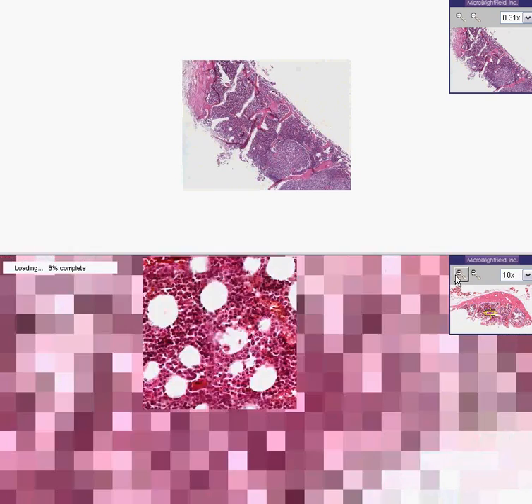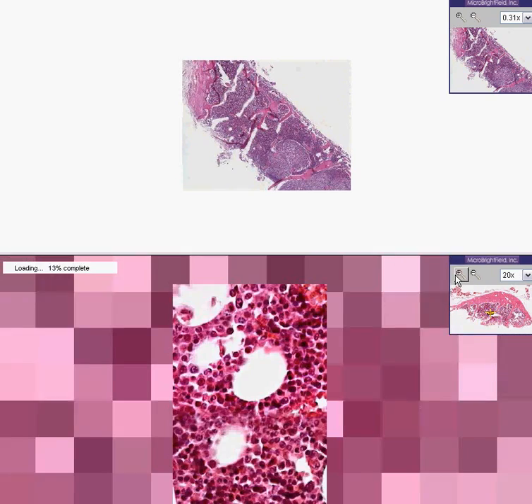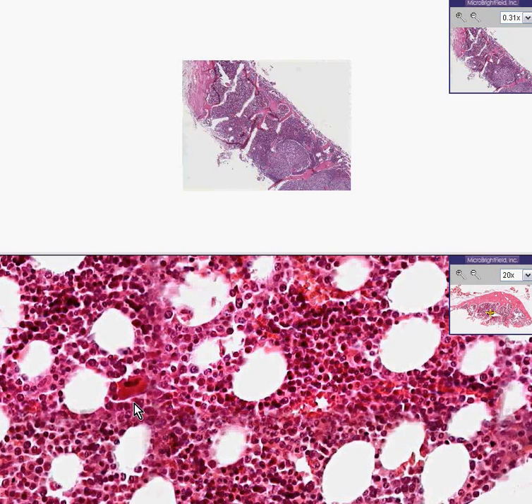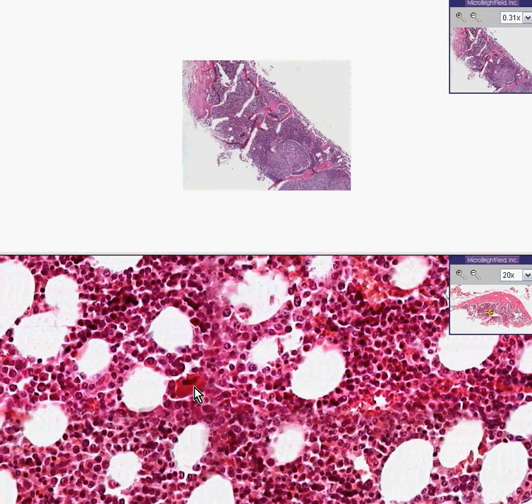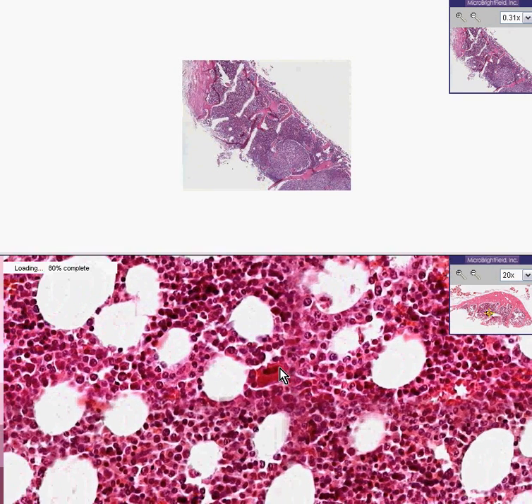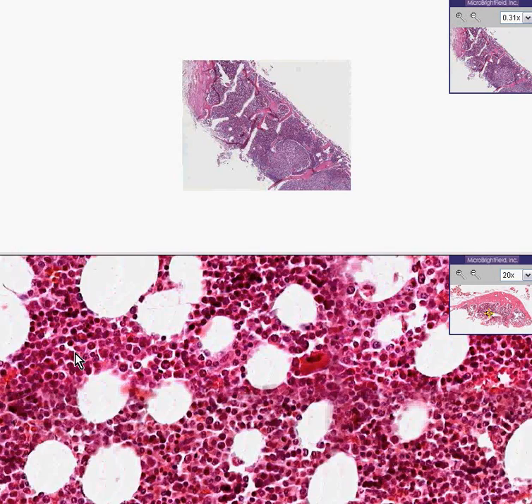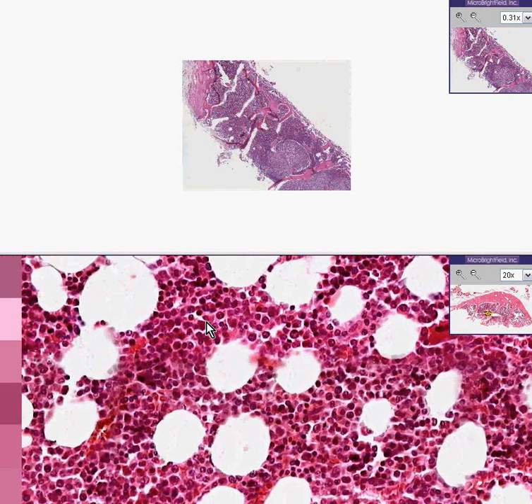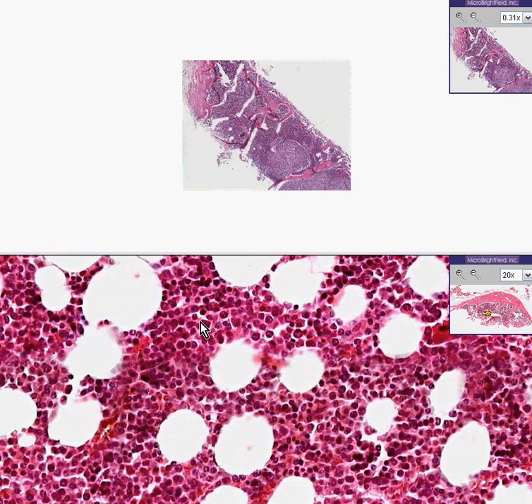Also notice that, like bone marrow should be, the hematopoietic cells are very heterogeneous. They don't all look like each other. Here's a megakaryocyte. These have such a wide variety of shapes and sizes. You know it is the normal degree of myelopoiesis and erythropoiesis.